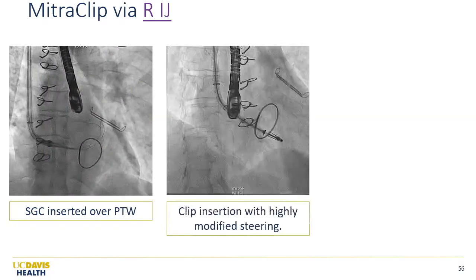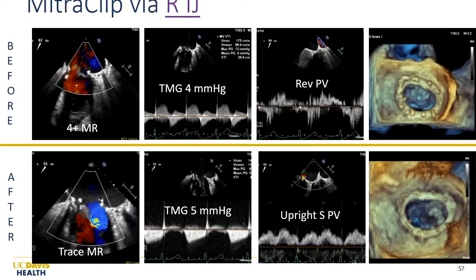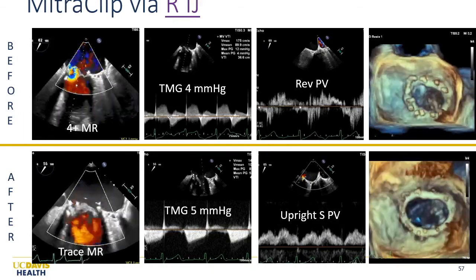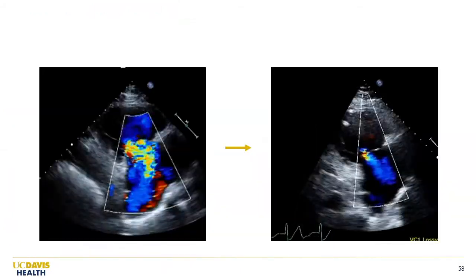We're actually able to come in and totally put in one clip. And here's a patient with severe mitral regurgitation before. We clipped this side of the valve where the regurgitation was coming from before. Again, these are some hemodynamic parameters, and that little tongue that you were seeing before, you don't see it coming back out at you anymore. And well, what about that tricuspid valve? Did we go after that tricuspid valve at this point? We didn't, because this was the tricuspid regurgitation before, and this was afterwards. So the TR got better.